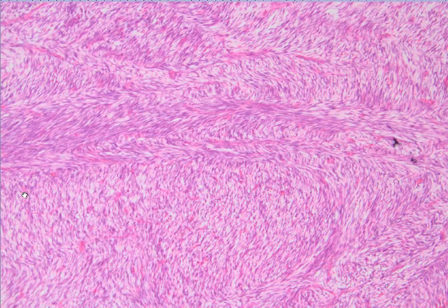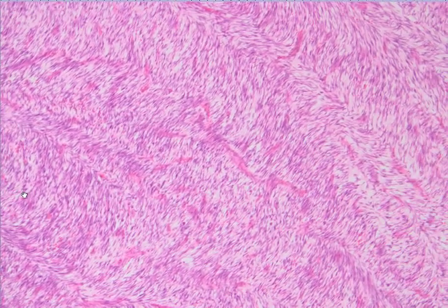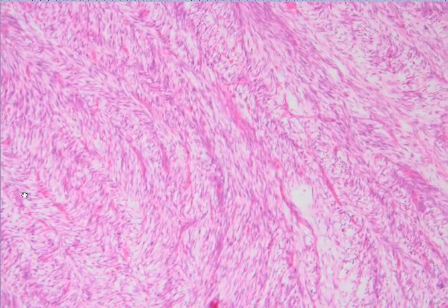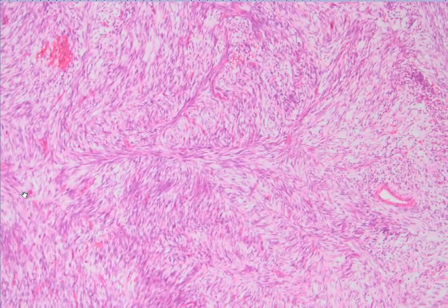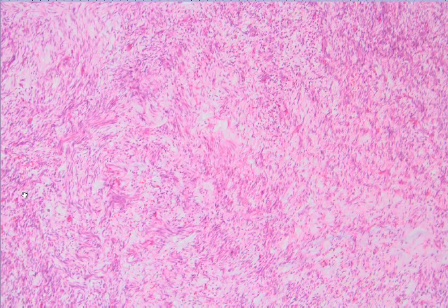Biphasic synovial sarcoma is morphologically diagnosable, except for the differential diagnosis of mesothelioma. But in the soft tissues, if you see biphasic synovial sarcoma, it's easy to diagnose without molecular testing. But in monophasic cases you may order molecular ancillary techniques to confirm or support the diagnosis of synovial sarcoma.